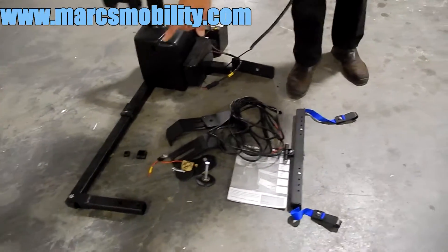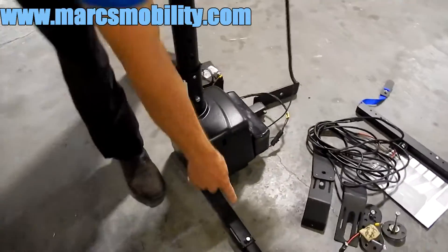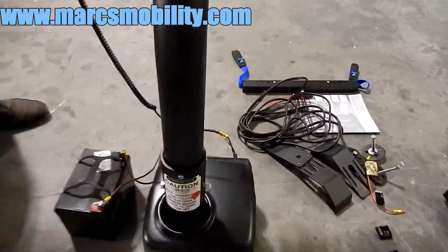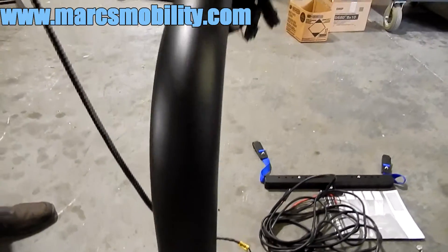It has the extra bars on the legs already — they can be removed, extended out, or cut in half depending on what vehicle you're putting it in. As I said, this lift is ready to go and it's in almost new condition.